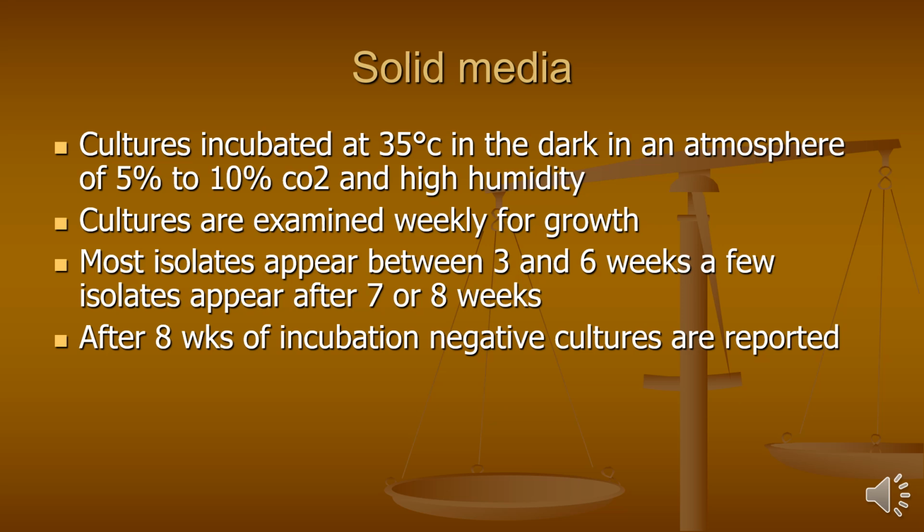So culture is incubated at 35 degrees Celsius in the dark in an atmosphere of 5 to 10% carbon dioxide and high humidity. Cultures are examined weekly for growth. Most isolates appear around 3 to 6 weeks of growth, and some may even grow around 7 to 8 weeks. After 8 weeks of incubation, as I told you, you can report the sample as negative if there is no growth.